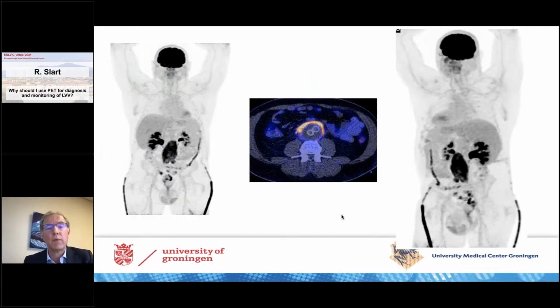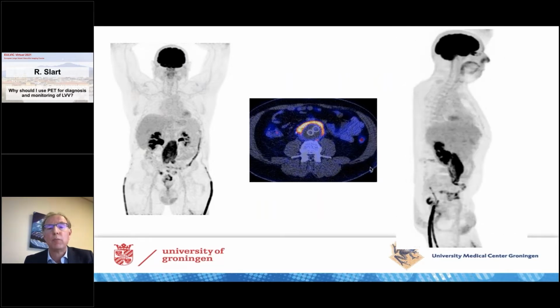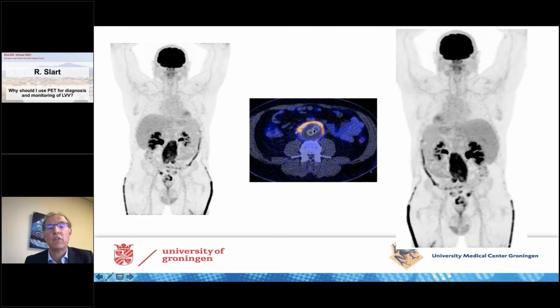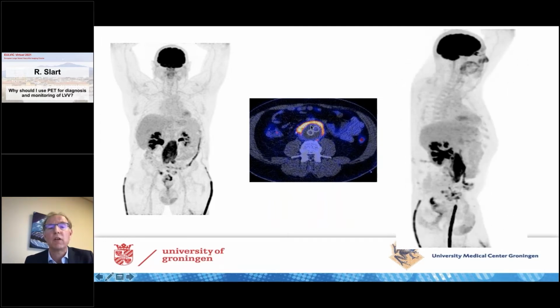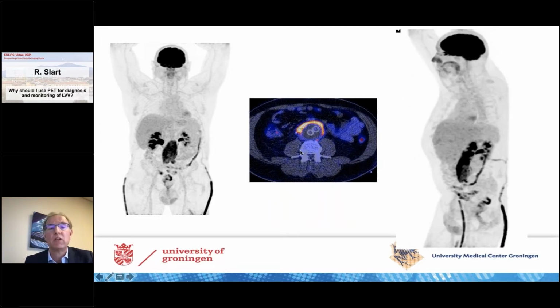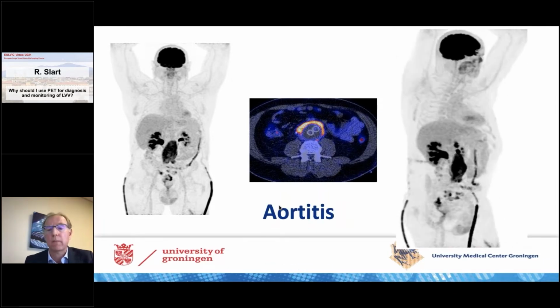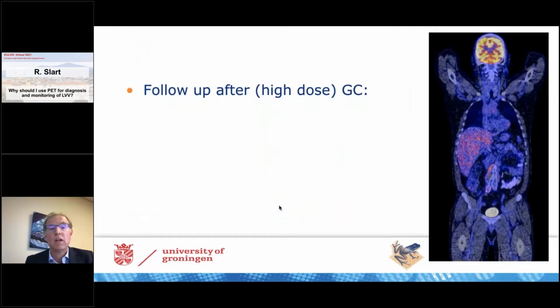This is another example of some patients. The intense uptake in the aorta region. And this is a patient after vascular prosthesis implantation. But later on, it seems that the cause is also the aortitis. This patient was treated with high dose steroids, and the activity completely disappeared.